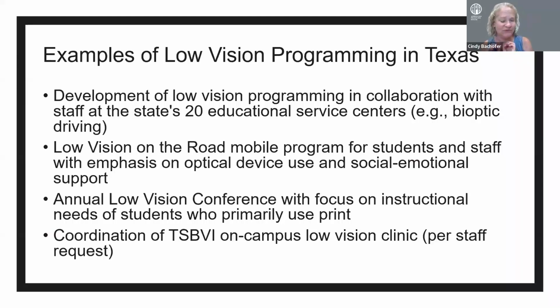My favorite one, I will hands down admit, is doing the Low Vision on the Road student program, where we collaborate with one of the regional centers to customize a day of activities. And it's very much optical device use based. So these students are getting together with peers and going out into the community for real life use of these tools. So it's more in your daily activities, not per se classroom based.